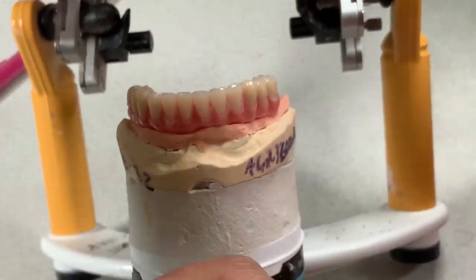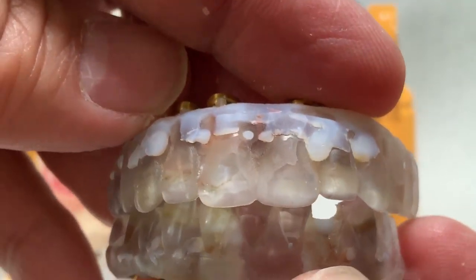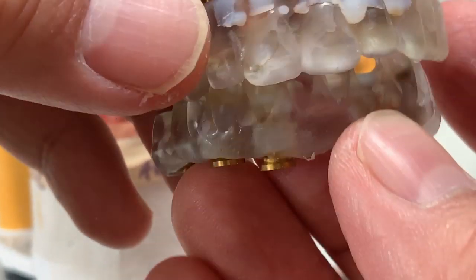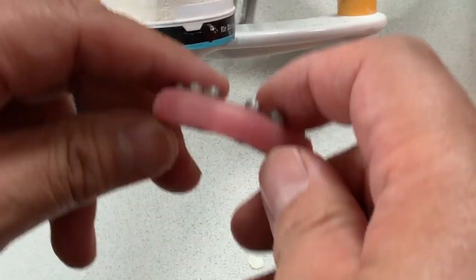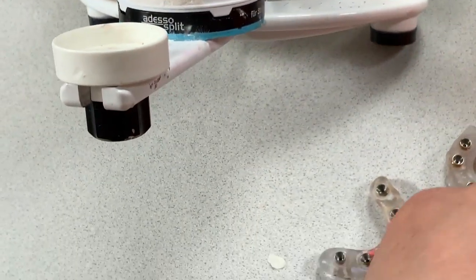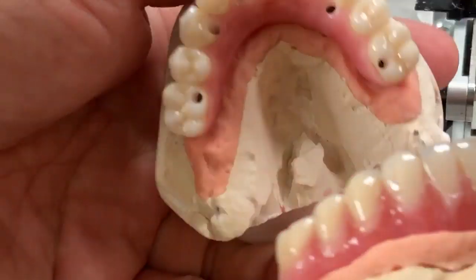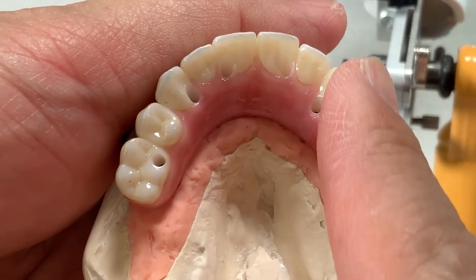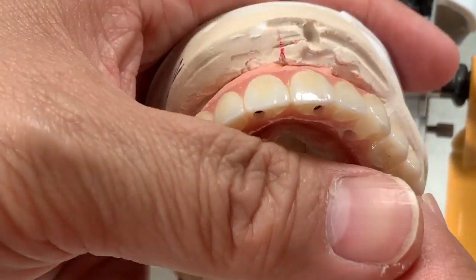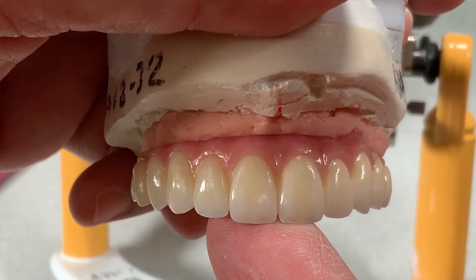Okay. And here's a story. The doctor gave us pretty good information from the beginning. Okay. And we made a verification jig and also a wax try-in setup. And we finally finished it. This is zirconia. Okay. And here is the aesthetics of our highest aesthetic, you see.